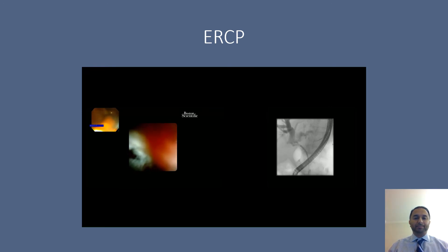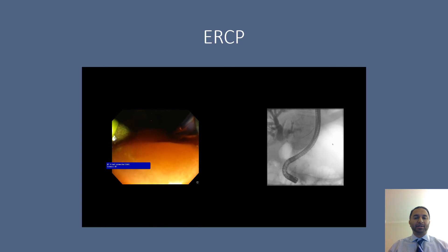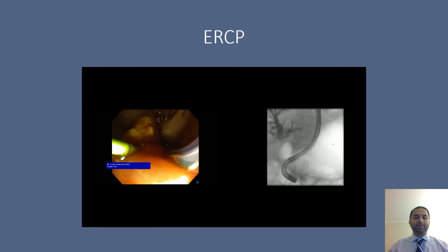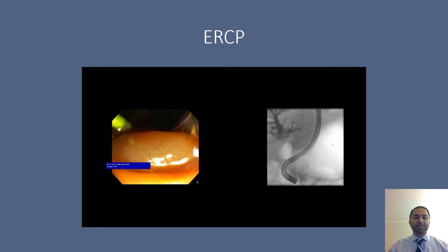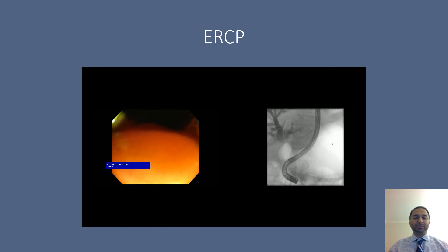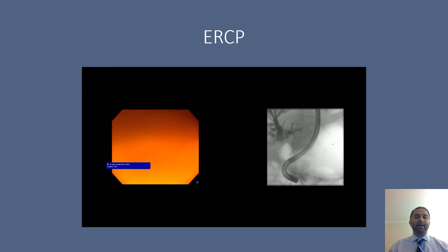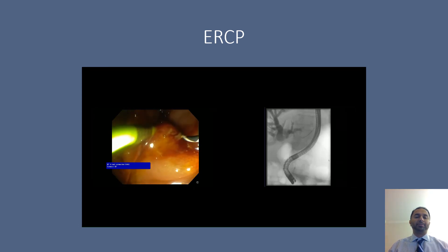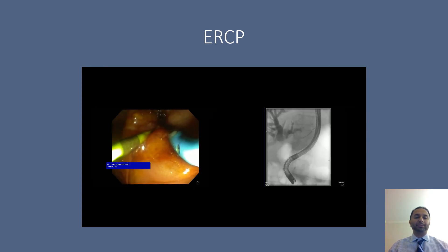Next, we're able to inject contrast to confirm we're in the right position. We advance a cytology brush to brush the hepatic hilum in order to obtain more tissue.